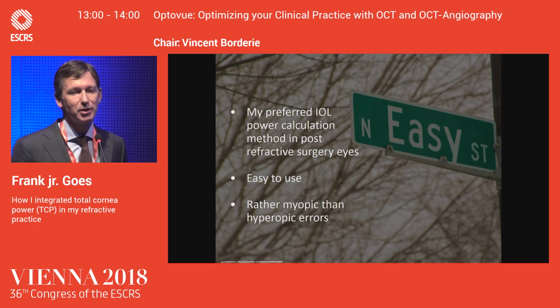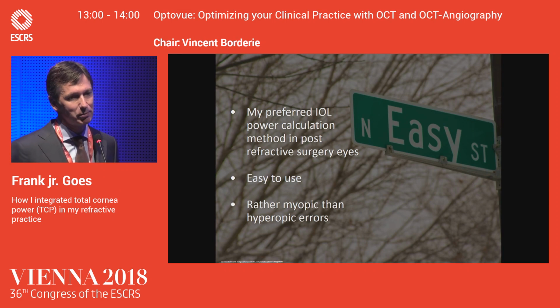Maybe you can increase the accuracy a little bit if you do all the calculations together and look at all the data, but if you have to choose one method, in my hands it would be the TCP method with the OCT. It's really easy to use. You don't have to call your colleagues. You don't have to go looking after previous refractive data. And you don't have to take into account the refractive difference between pre-op and post of the laser treatment.